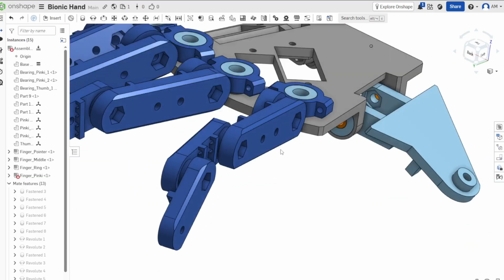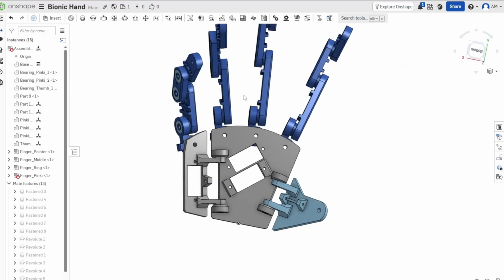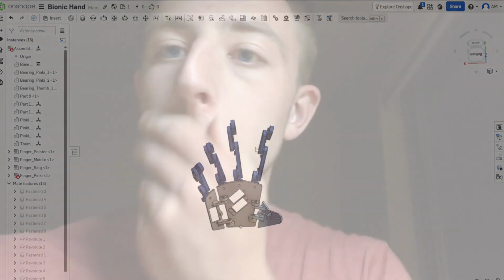I haven't finished modeling the meat on these fingers for this new model. I'm just going to make it as a skeleton first. If it works, then add meat. So I want to print this stuff before I go to bed, because it's really late. I need to go to bed.